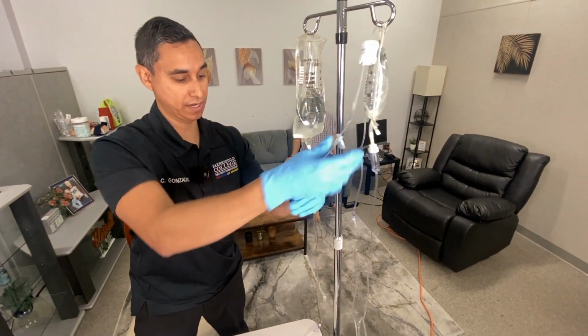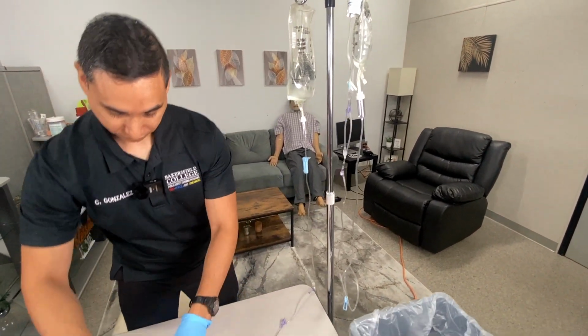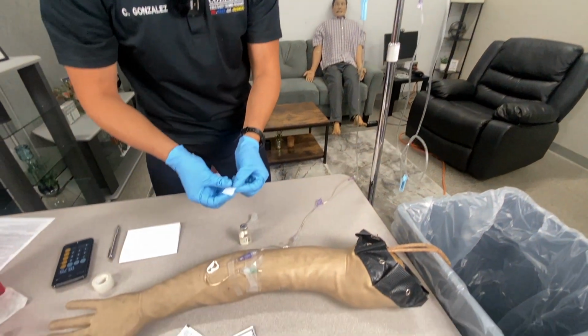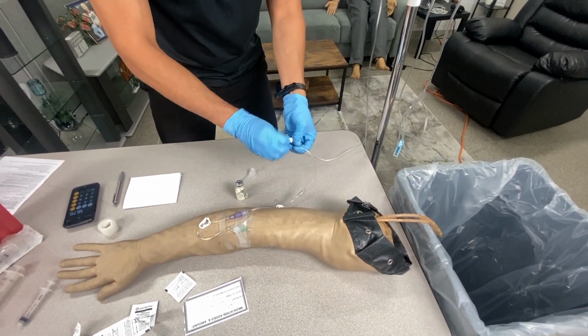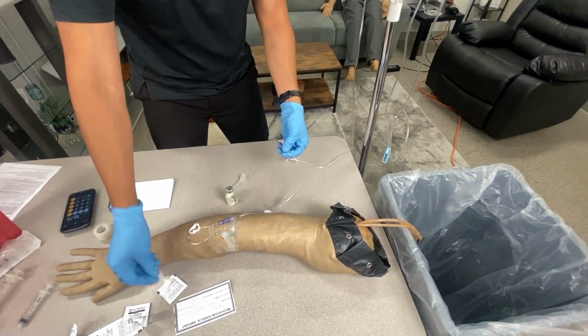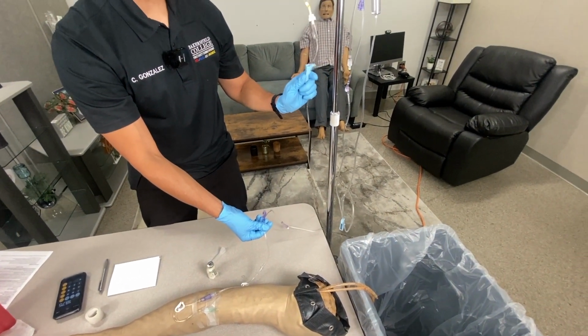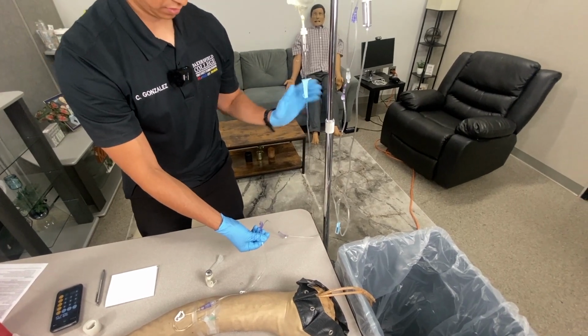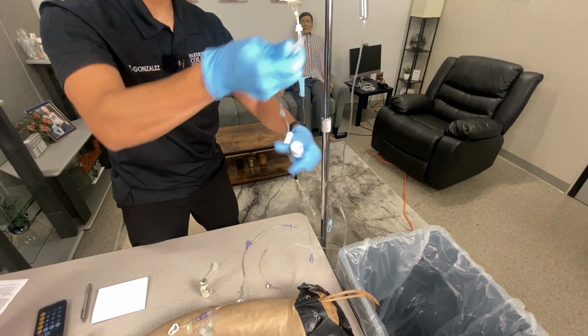So before we connect, we are going to cleanse the port. Cleanse the port. And make sure that we run our normal saline at TKO. Let's connect the dopamine bag.